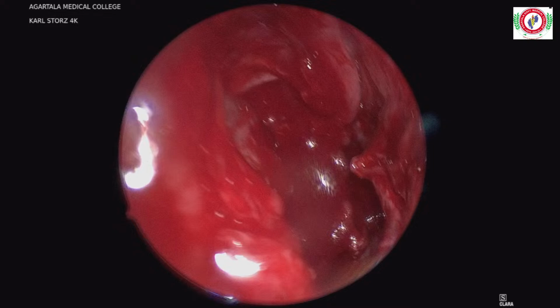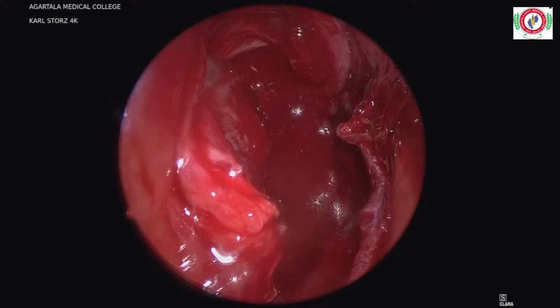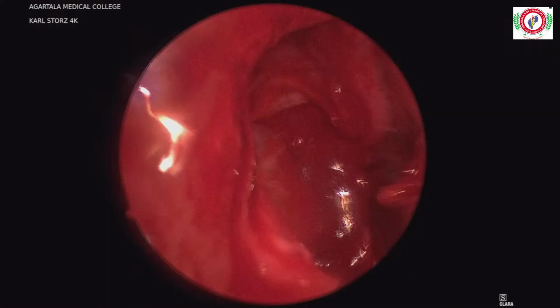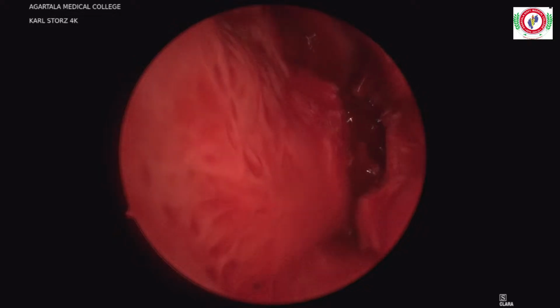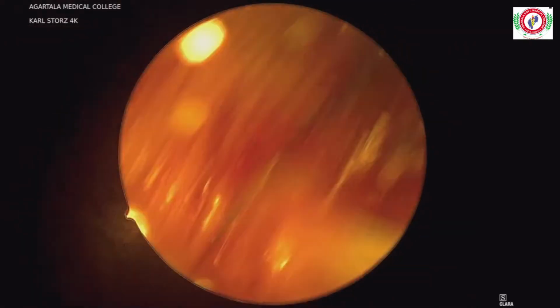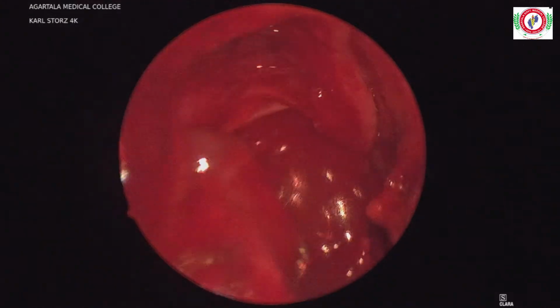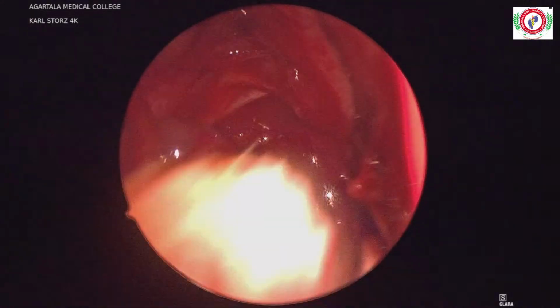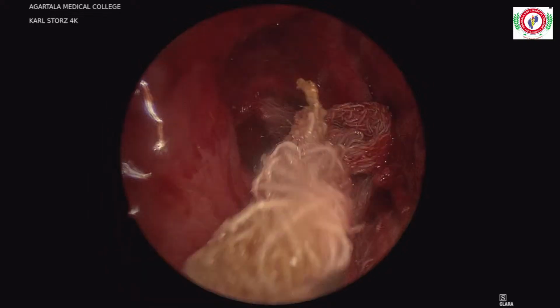Use the cautery to make a cut there. So I'll just use this. Maybe this will work here. No, it is also not cutting. You see? It is not working properly. It is not cutting. I have removed it partially. If required, I'll remove it completely, then I'll make an opening along the inferior side. Give me pack.